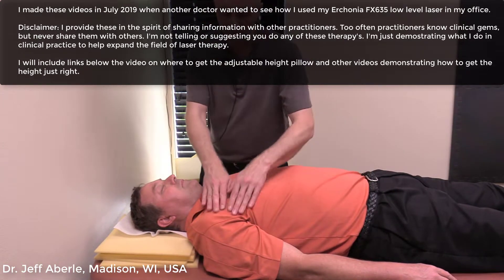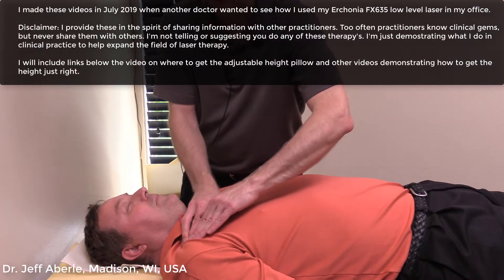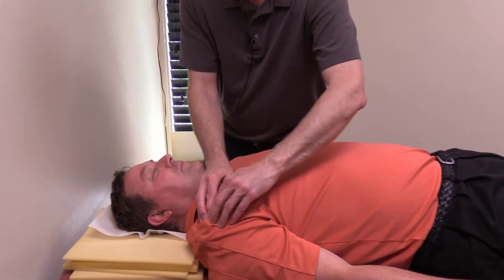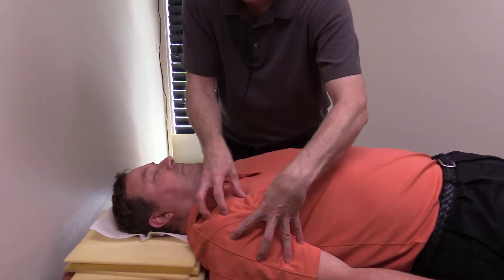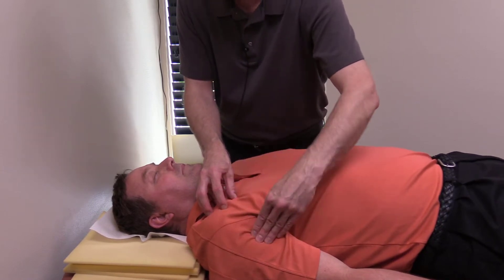When a person's on their back, you can just come in here and feel. Right there I can feel that there's issues, and this is clearly deltoid muscle — I can tell because the fibers are running like this. So that's a spot where I'd put the laser, just plop it right down here, one there, probably the middle one in this general vicinity, and the other one down here.